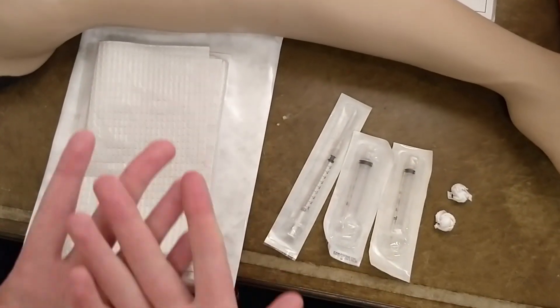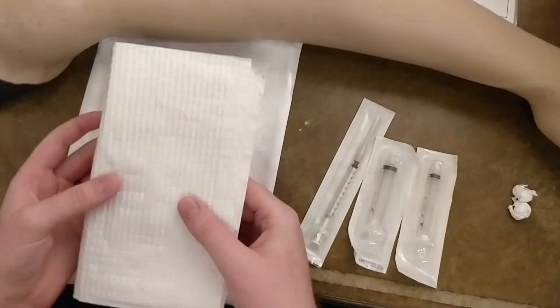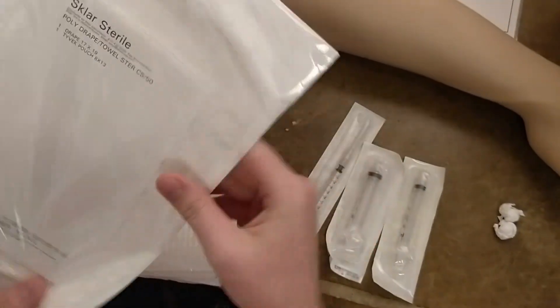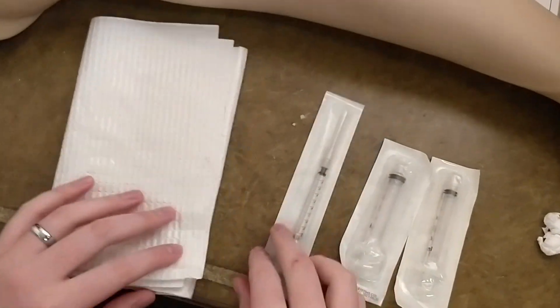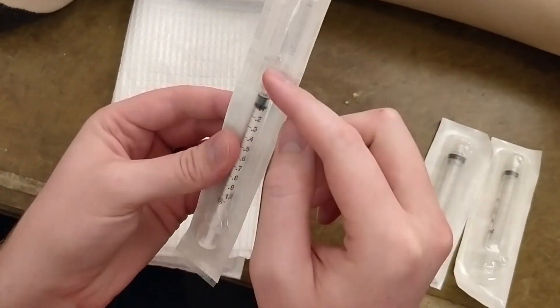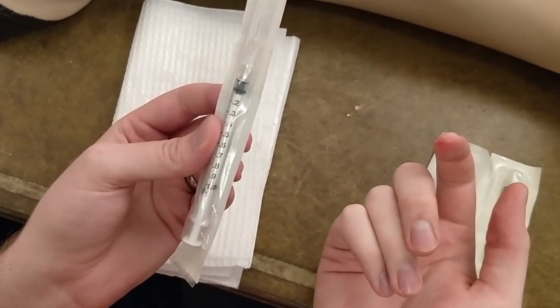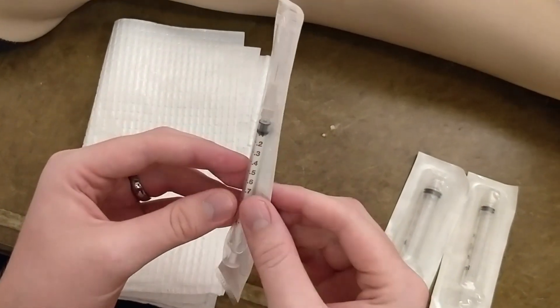My name is Matt Doerr and I will be teaching you the injections portion of the NBEO. Some precautions: we are using an old drape just so we don't waste our good ones that are in a sterile package, but the ones you will be using will be in a sterile package. For our IM injection, the needles currently have a syringe and needle both attached on boards. I am not certain if they will be separated or together — you just have to make the adjustment by grabbing an extra needle if they are separate.